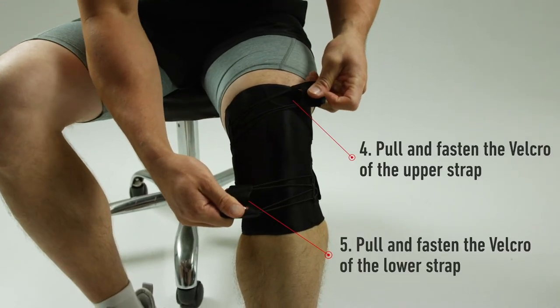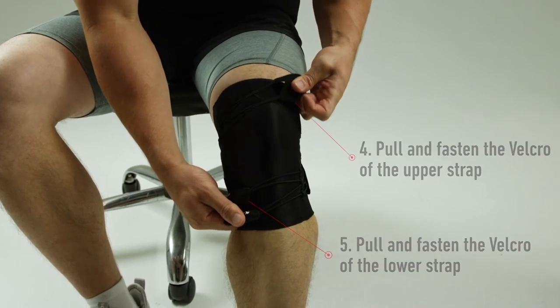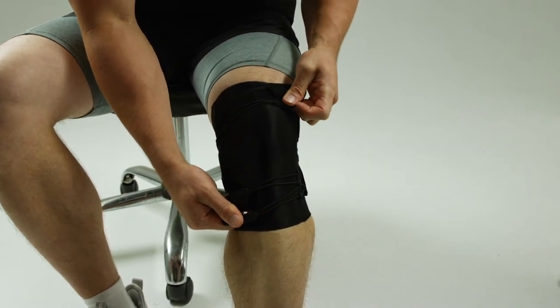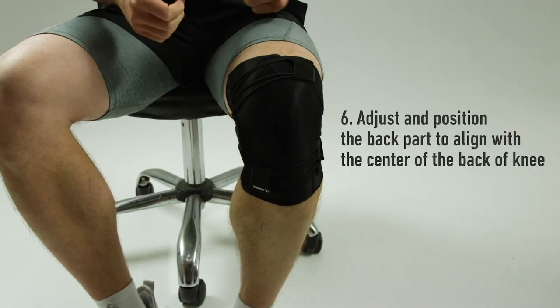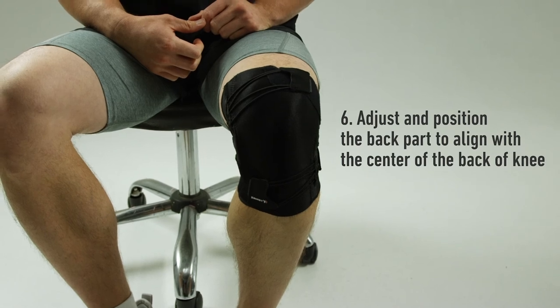Straightening your knee, pull and fasten the Velcro of the upper strap. Re-adjusting the compression of the strap, adjust and position the back part to align with the center of the back of your knee.